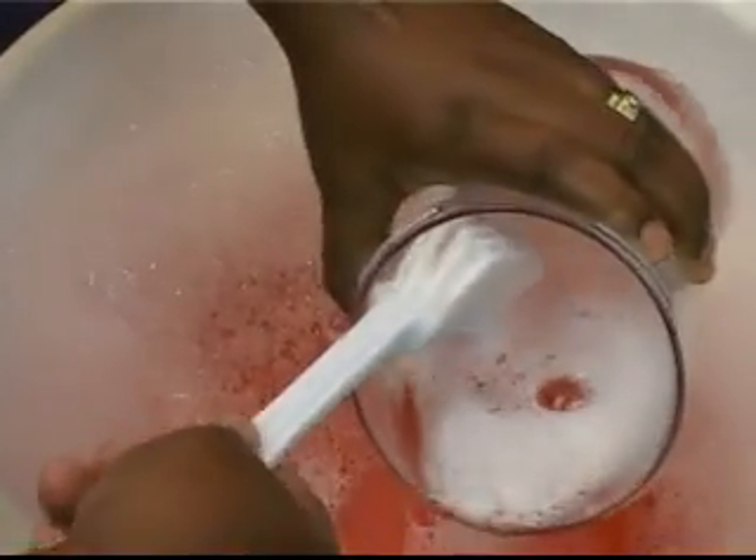First, flush the tubes through with hot soapy water. Then, use a brush to clean the collection jar and cap. While you are cleaning, make sure that all connection openings are free of blockages.